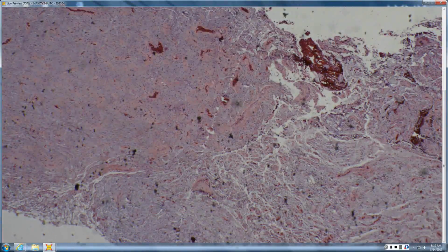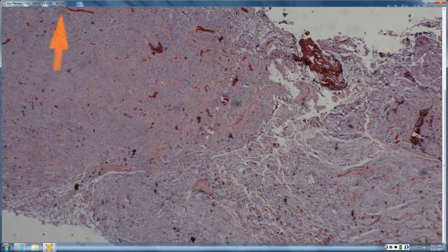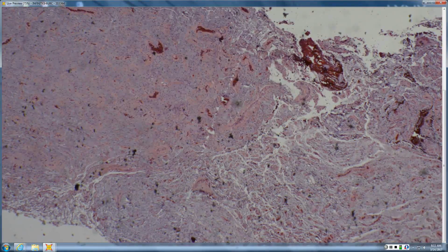How do you think those might behave? Probably aggressive. They're kind of deep, infiltrative tumors. So they have these curvilinear vessels, and they're equal parts angio and myxoid. So, again, very descriptive. They're angiomyxomas. Remember, the superficial angiomyxomas are benign, but in the vulva, there are those aggressive angiomyxomas, which tend to be in adult women, very destructive, infiltrative vulvar tumors.